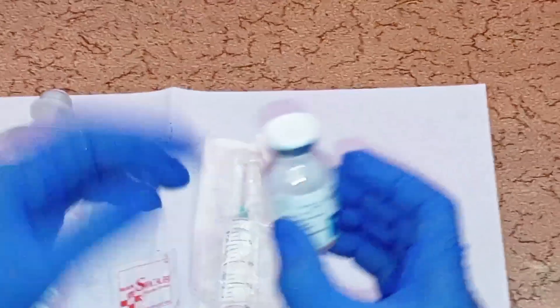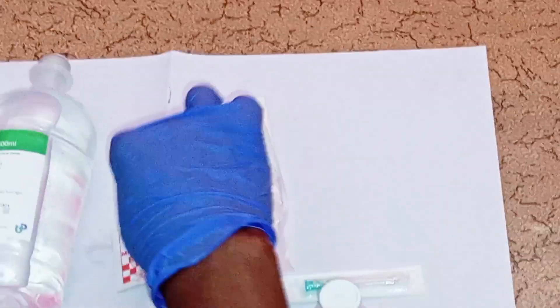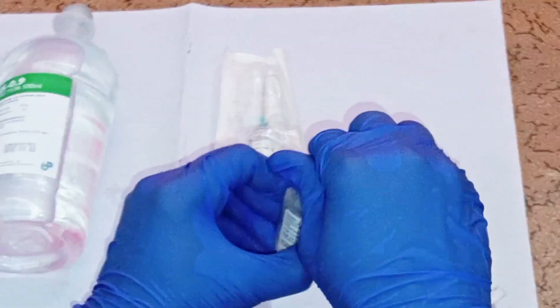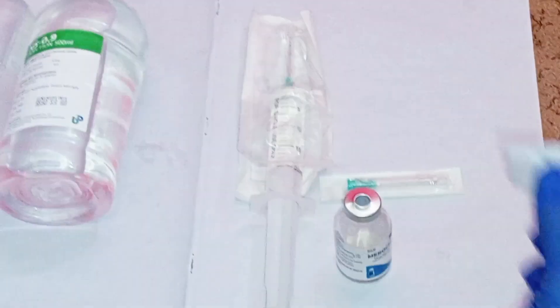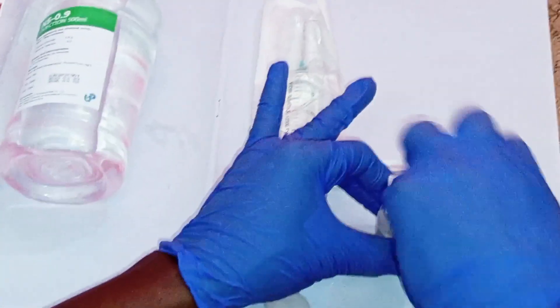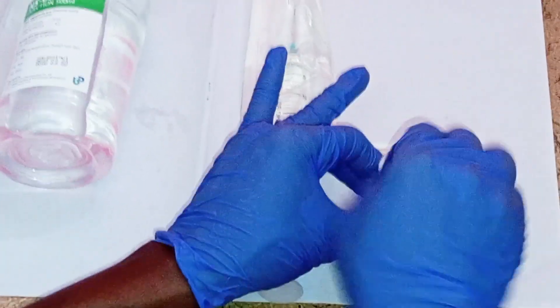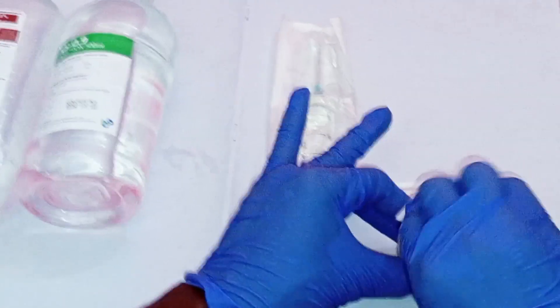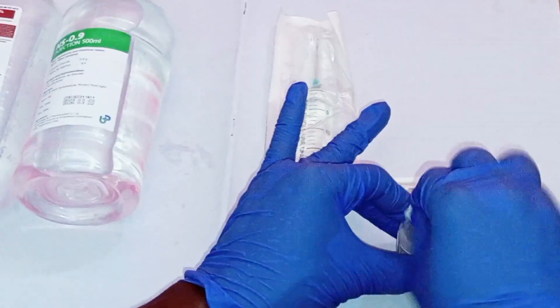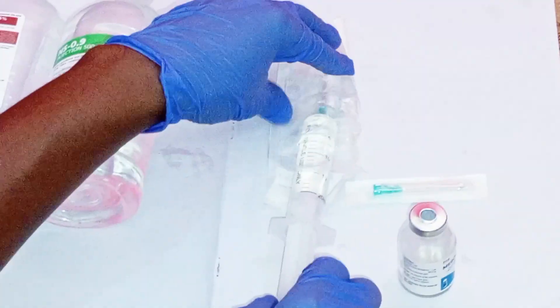Get the vial containing the white powder of meropenem one gram for injection. Flip off the top of the vial, then get an alcohol swab and clean the rubber stopper of the vial for at least 20 seconds. Allow the vial to dry for a few seconds. Make sure you clean the opening of the vial with alcohol swabs prior to dilution.